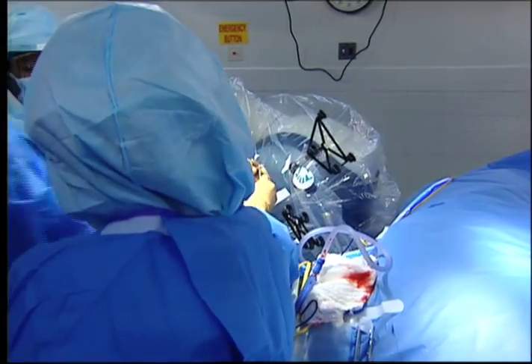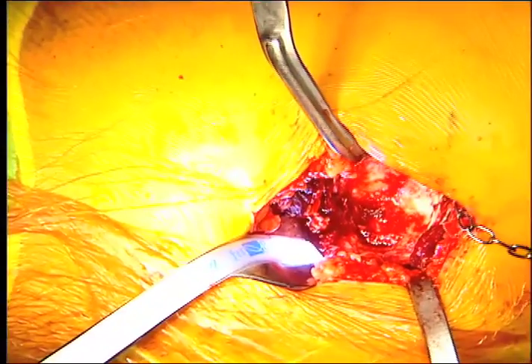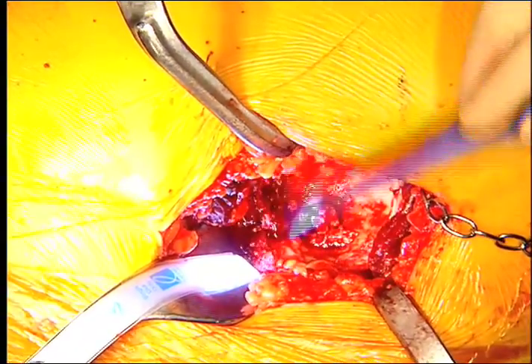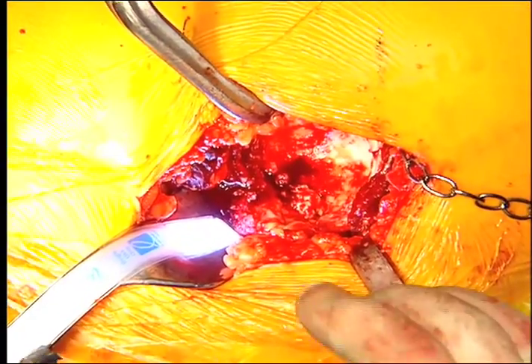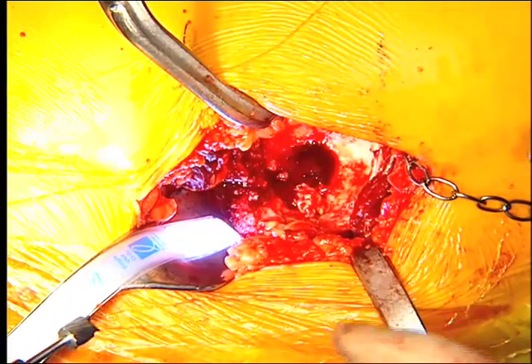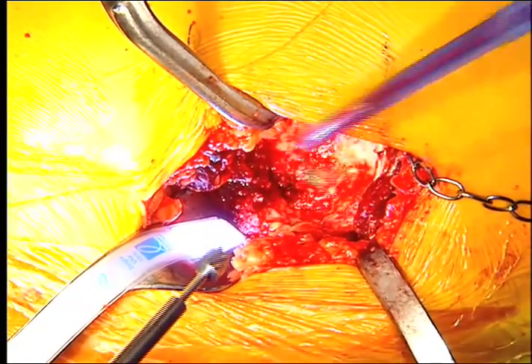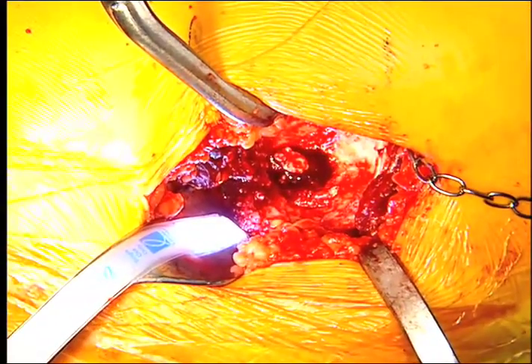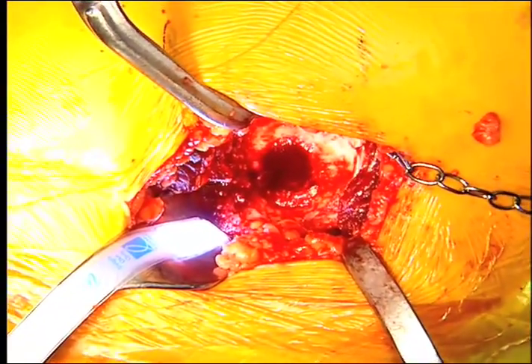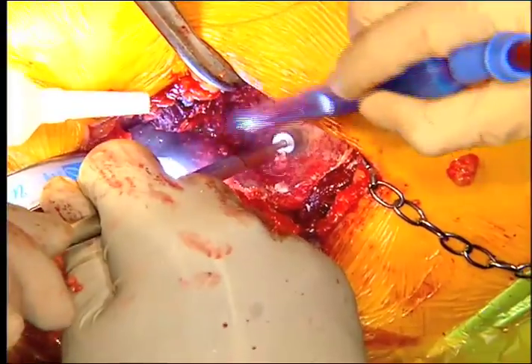The biggest challenge with acceptance of these machines is the change they cause in the OR. But one of the most satisfying things for me is that with the machine I know that with every patient I operate, I give them the same equal chance for a superior result. When operating on experience and instincts alone, I'm pretty good — my data is in the literature — but I still have outliers. Every patient wants not to be an outlier. This gives me the best chance to tell every patient that I'm going to do their operation right.